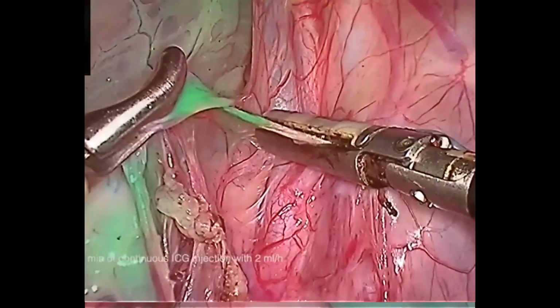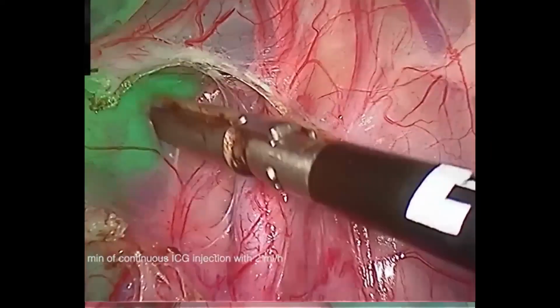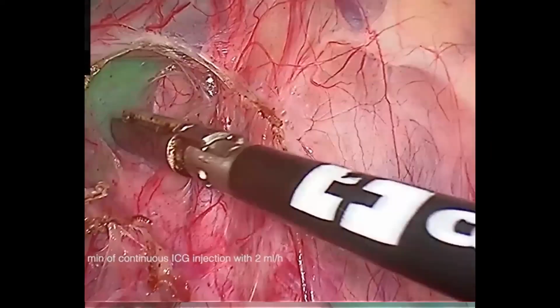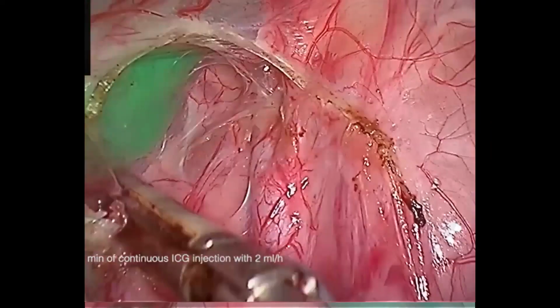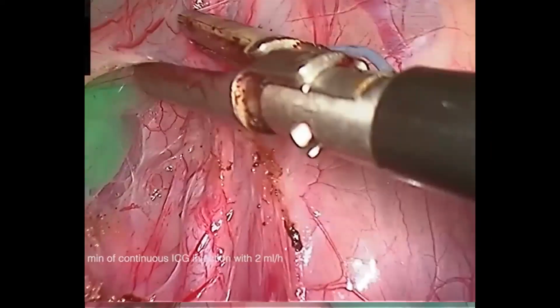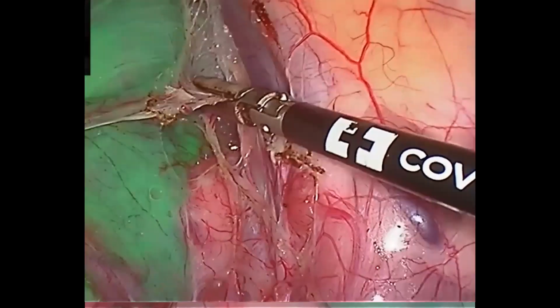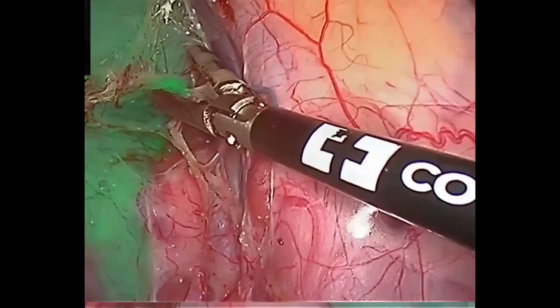separated and cut. So here we are not worried about the ureter, we are not worried about the hypogastric nerves, because they are not at all illuminated. They are not at all green in color. So we are removing only the green tissues. So we are perfectly in a plane. Even a surgeon who is doing it for the first time will go into only that plane. So he will have a great learning. The learning curve will be reduced, and he will be very safe.